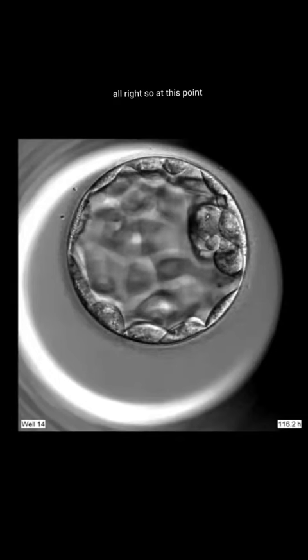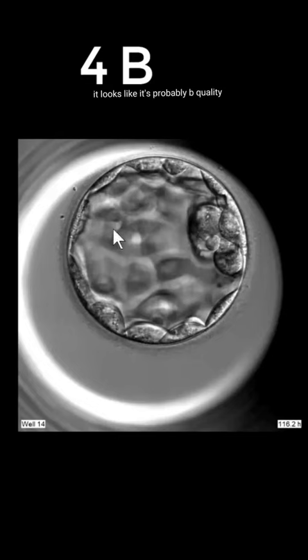All right, so at this point, we could pretty much grade the embryo. So it's about 120 hours, that's 5 days. The thinness of the zona suggests that it's a four. The size of the inner cell mass, it's not too big. It looks like it's probably B quality. The amount of cells in the trophectoderm look about A quality. So probably a 4BA.